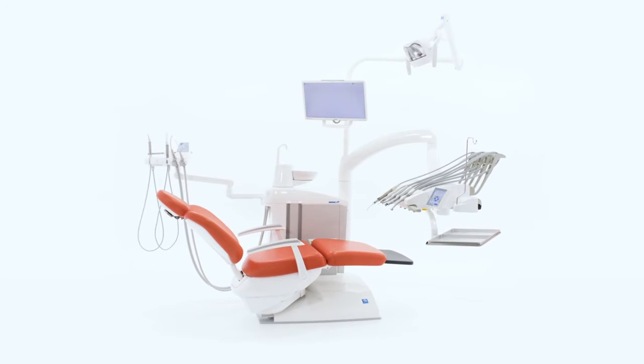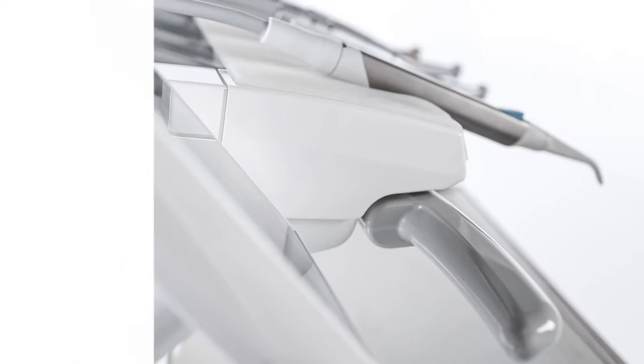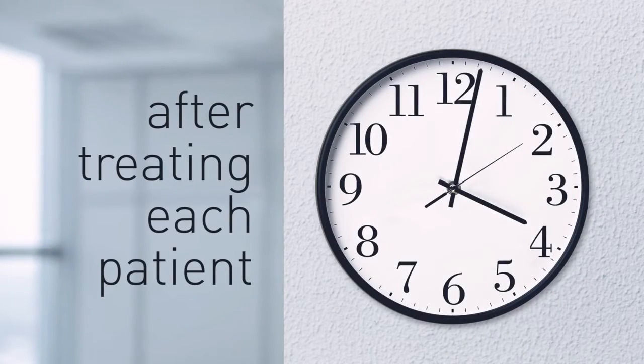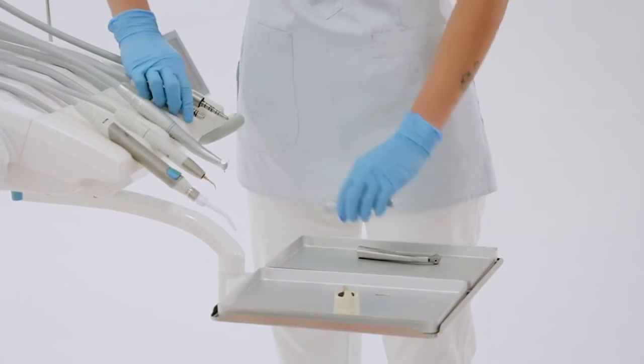Hygiene for Sternweber is a set of advanced active systems and passive protection devices. In this video we will demonstrate the importance of the systems and procedures necessary to ensure a flawless level of hygiene in any clinical environment.